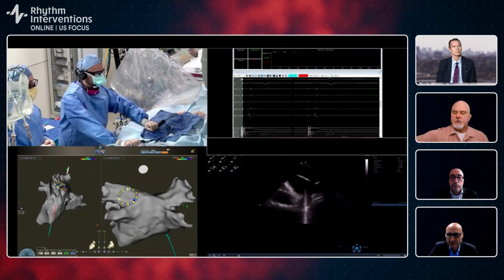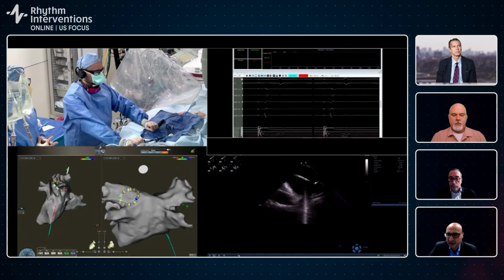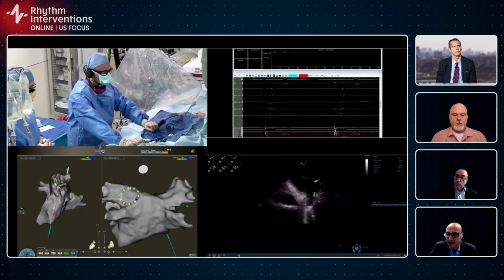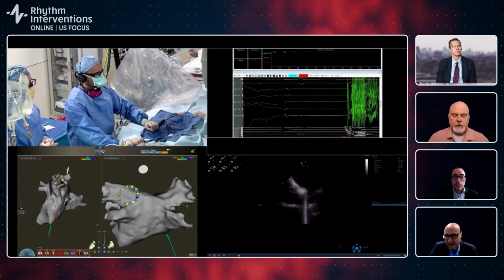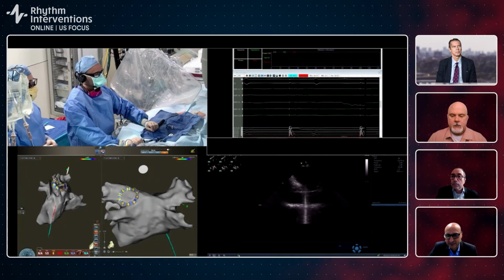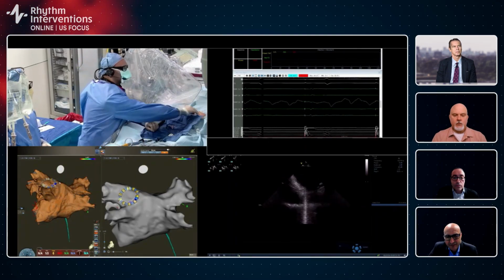And we wanted, in the first few patients in the study, to compare the mapping ability of this catheter to mapping only catheters such as a penta-ray, which have maybe higher fidelity of treatment. So this catheter, as you see it there, is a circular catheter.